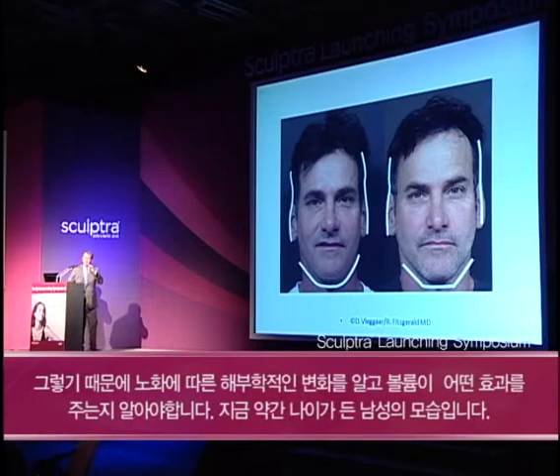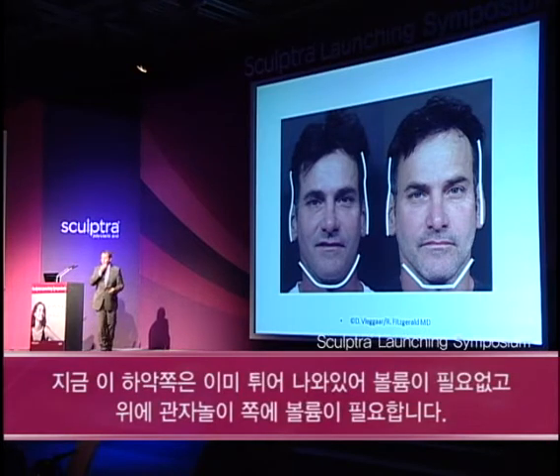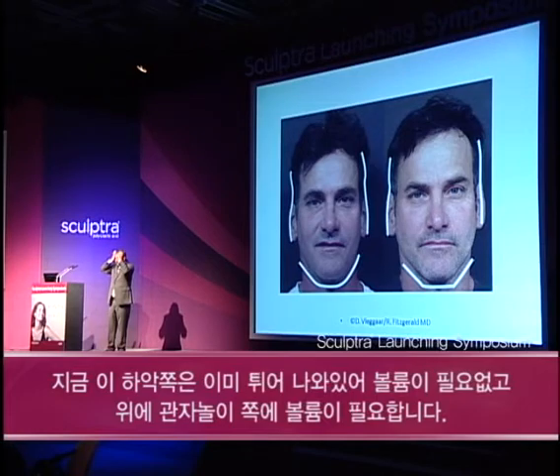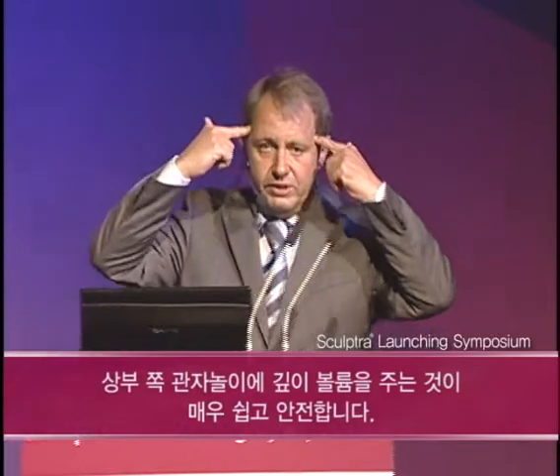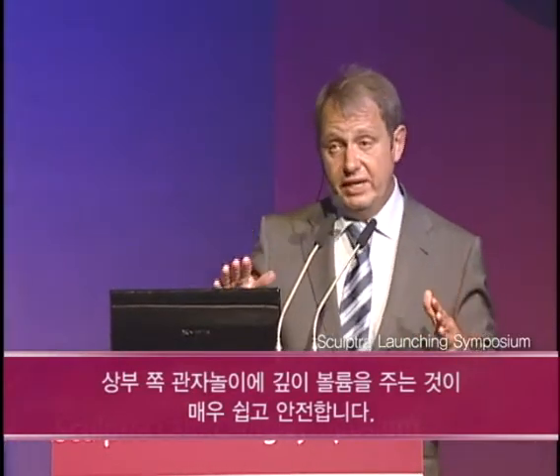And this is an aging man, and you see an aging man, we are already prominent here. We don't need volume here. We need volume here, man. We need to widen out in the upper face. Deep in the temple fossa is very easy, it's very safe. You go straight through the temporalis muscle. When you touch almost bone, you give little depots of 0.3 milliliters of a 9 ml dilution of Sculptra in a row. And you do it 1, 2, or 3 times, depending on the volume loss.